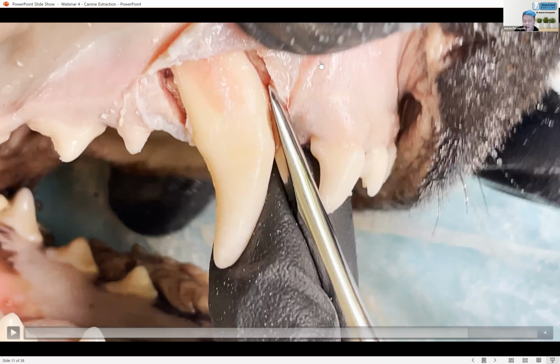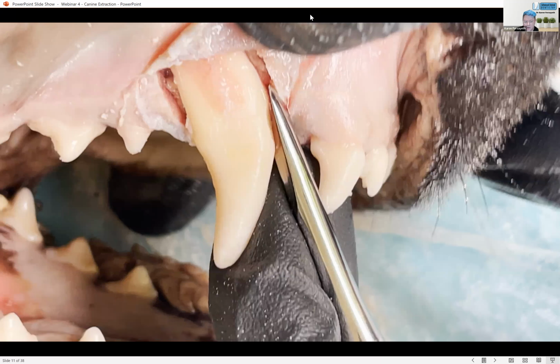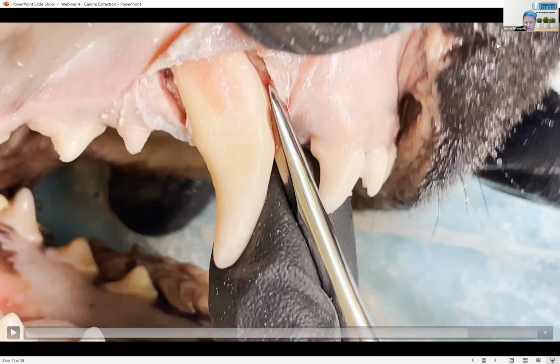And I guess, again, going back to workshops and working with students who are doing this for the very first time, it is, as Beck said, a pretty natural thing to do. You put some force on, then you pull it all out, and then you start again. But often they go back to the same thing. They get nowhere. So we'll keep pushing on with this dog, and again, fingers crossed, Beck can place enough force on this to break down the periodontal ligament.